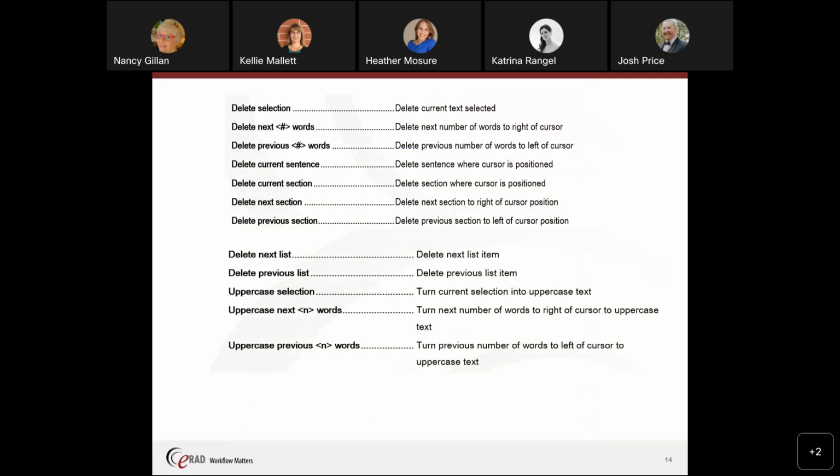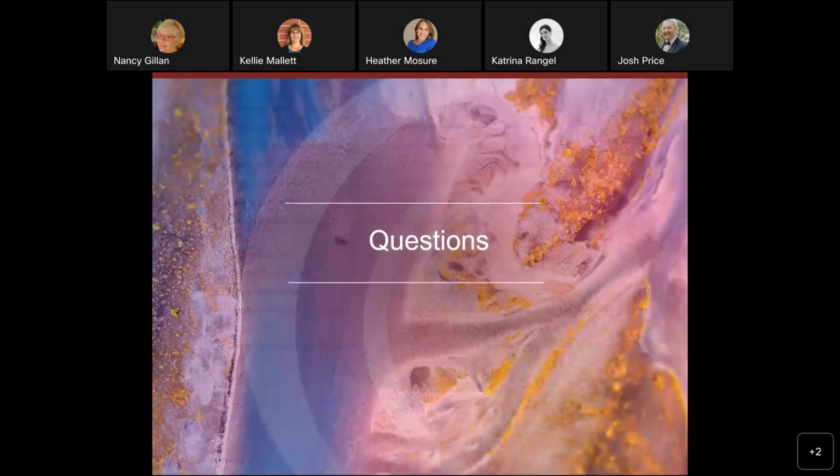So I know that that was a lot of information in a short period of time. But do we have any questions? I'm going to turn off the recording so we can feel free to ask questions.